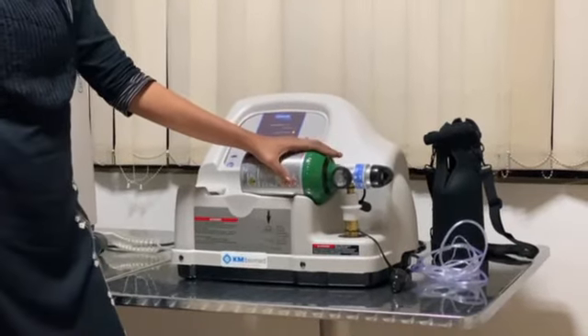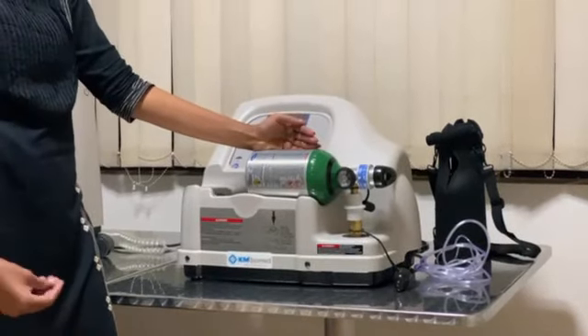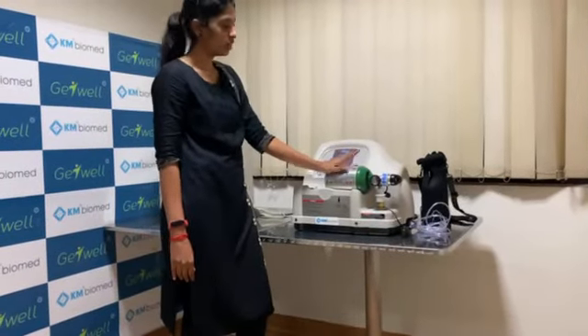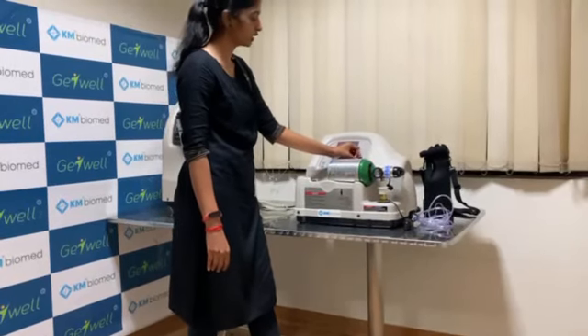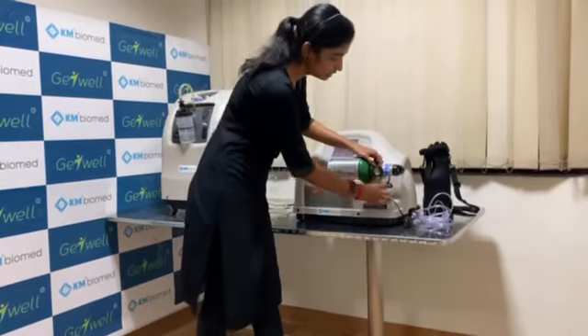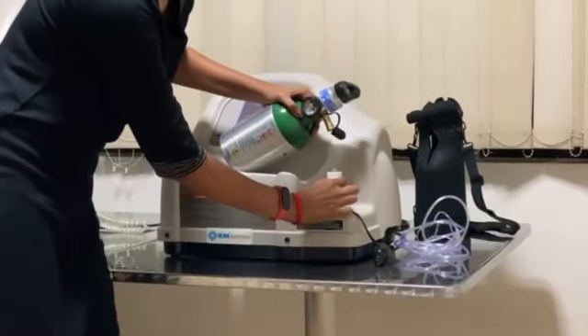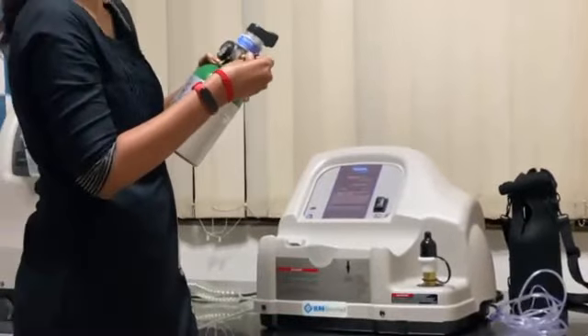There is also an added advantage — you need not sit and wait for the system to fill. Once it is full, the system automatically shuts off. This is the advantage. Once your oxygen cylinder is filled, you can come and fix off this machine and push down the coupler outer ring to release the cylinder. Once it is done, you can close the cap and also the protective cap.